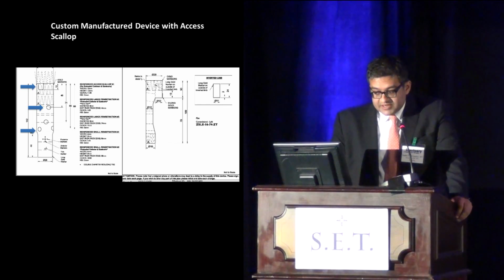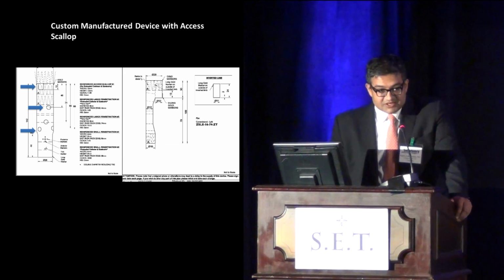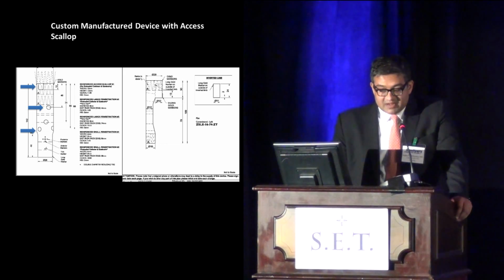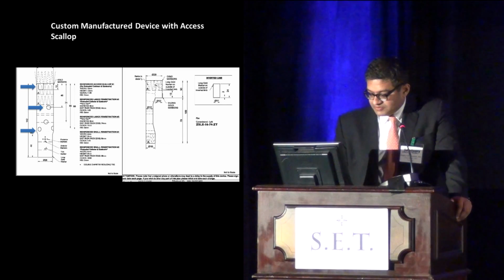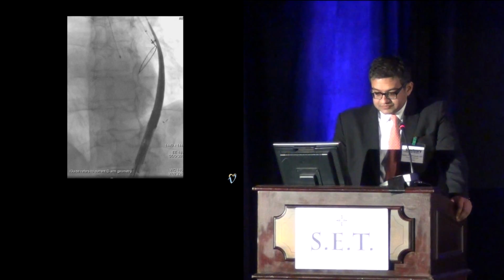Also of note, on the right, you'll see an inverted limb device, which is used to treat these patients with short main body grafts, and has an inverted limb to be able to hold the device, because there's not a lot of room in these patients.